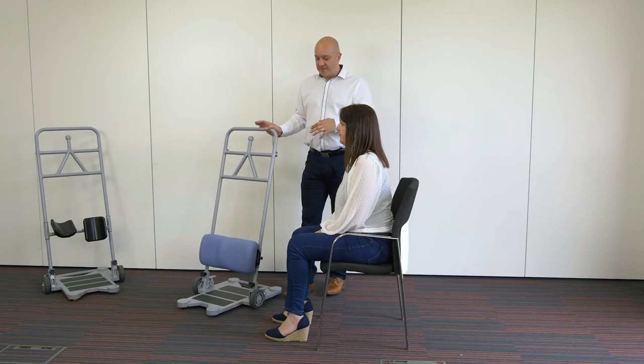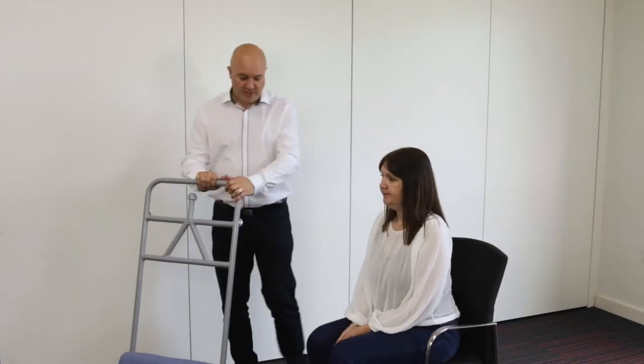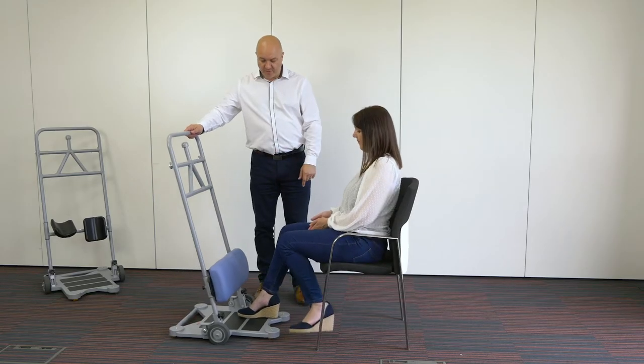The first thing we need to do is ask Sarah to shuffle forward slightly in the chair. I'm going to introduce the razor — Sarah can put her feet on there, or if somebody needs a bit of assistance you can get down and assist one or both legs onto the footplate.